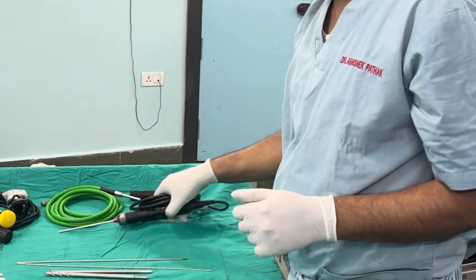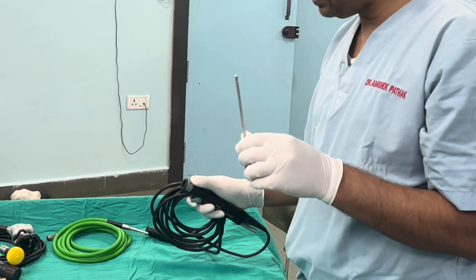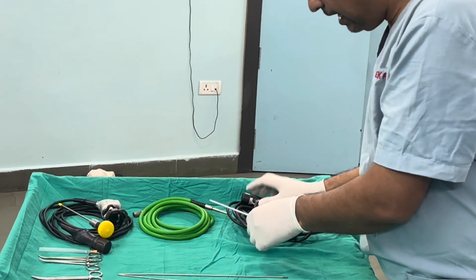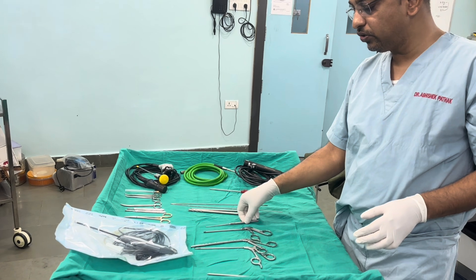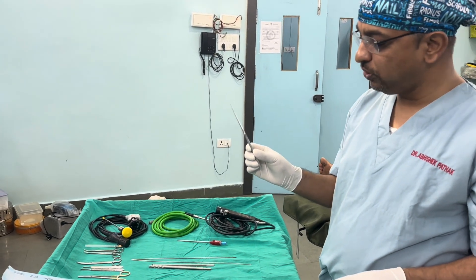This is the shaver handpiece with a shaver blade attached to it. There are various kinds of shaver blades available, as well as burrs. The most important basic instrument for knee arthroscopy or any other arthroscopy is the probe.